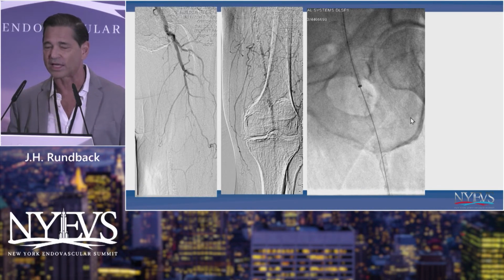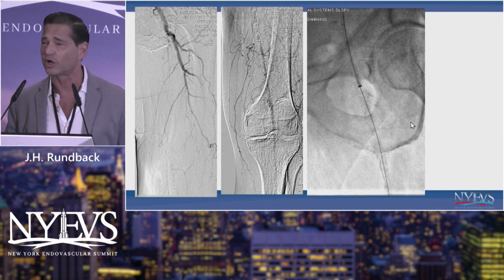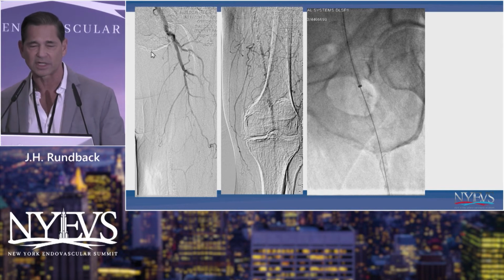Generally at that point, we like to go ahead, and actually it's a different case, we like to go ahead and just take a 5 millimeter hydrophilic coated balloon and bring that, usually an 035 approach in our case. Here we see it again. This one has a little bit of proximal SFA that you can see, reconstitutes a lot of calcium.